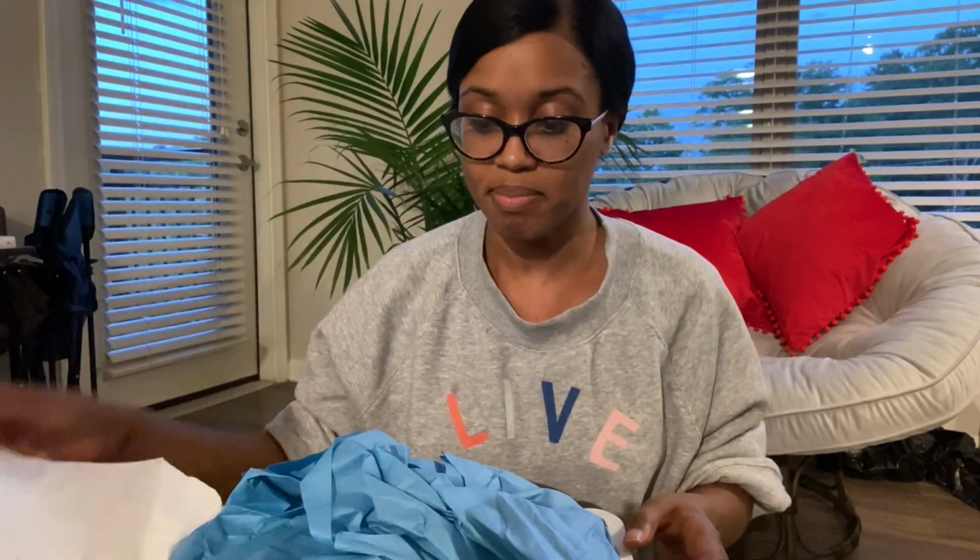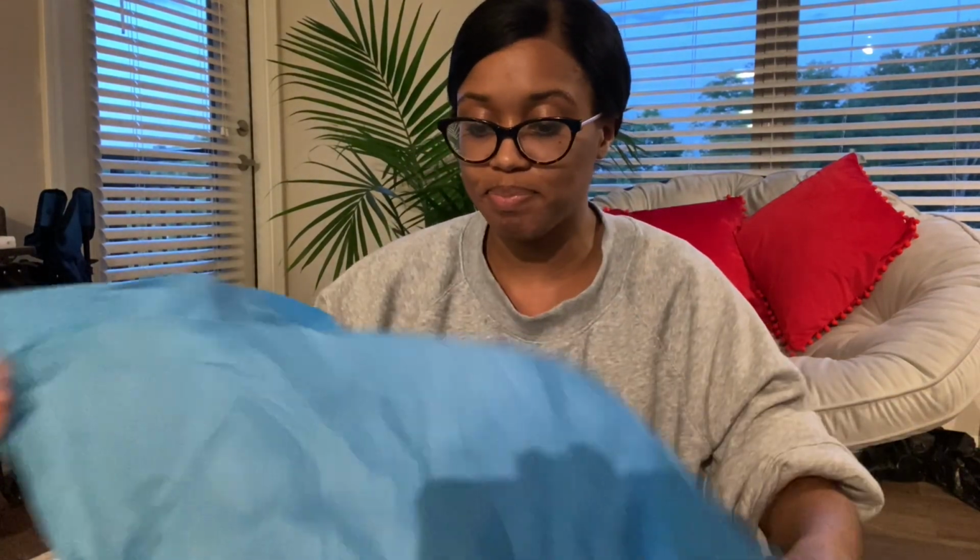So if I was in the hospital, I'd definitely have sterile gloves on, a mask, my scrub hat, because it's a sterile procedure. But I'm in my apartment, so I'm just gonna open it up just so you guys can see what's inside. So this would be nicely folded, and you would open it up.